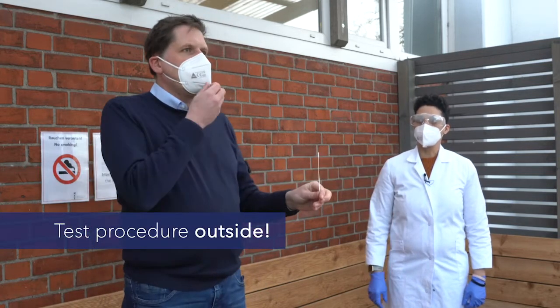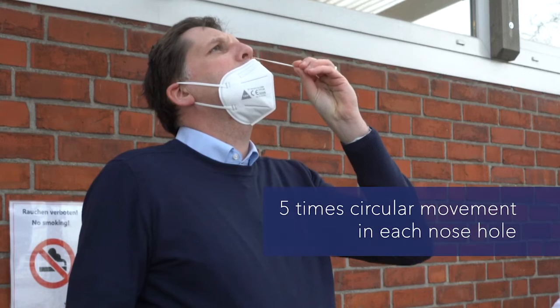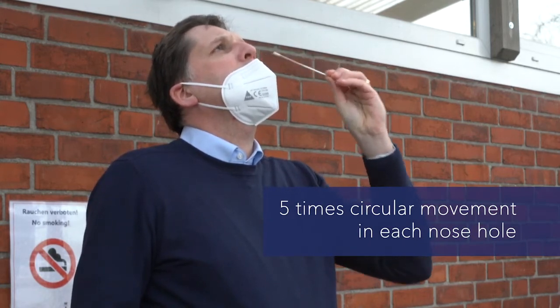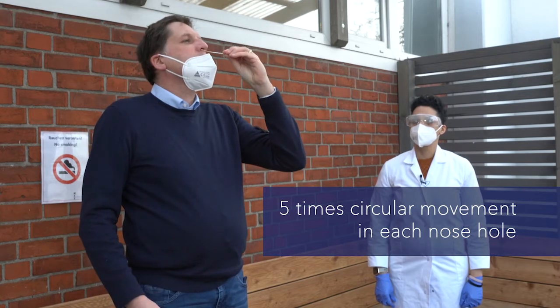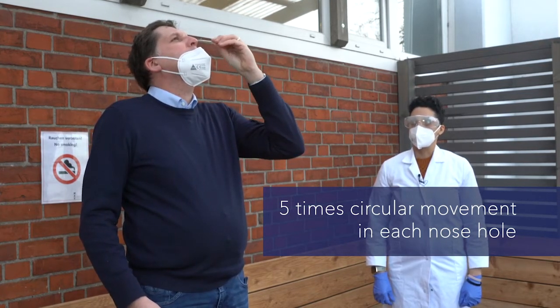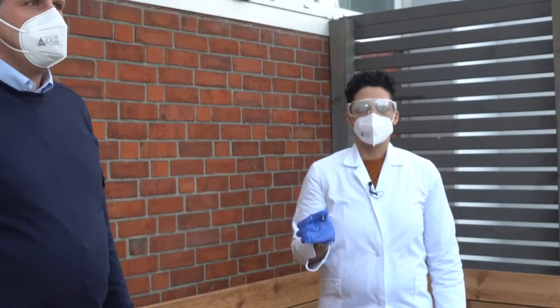So our proband, I'm going to hand him the swab. He's going to put the nasal mouth protection down a little bit, lean his head backwards, and 5 times in a circular movement go in each nostril to take with the swab. The other side, please. Very good, 5 times. This is the regular test.